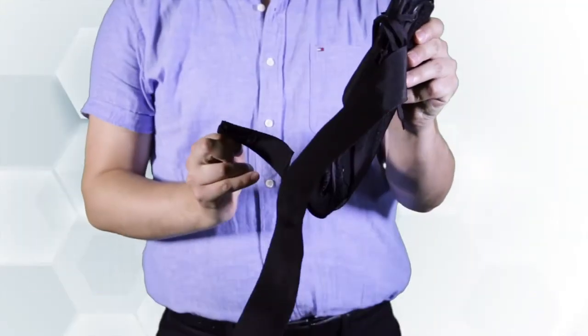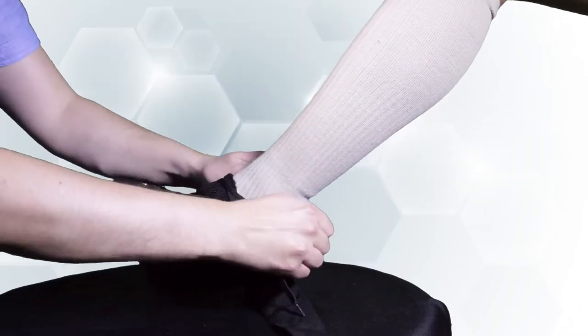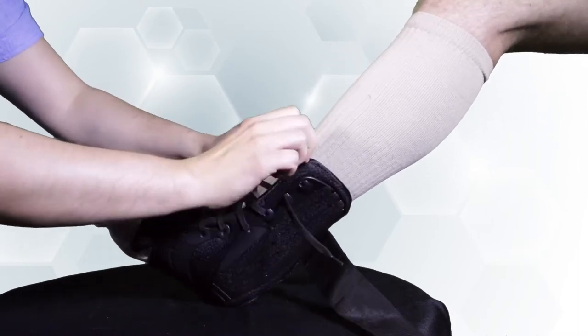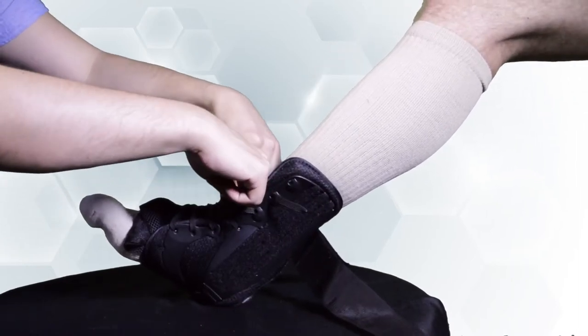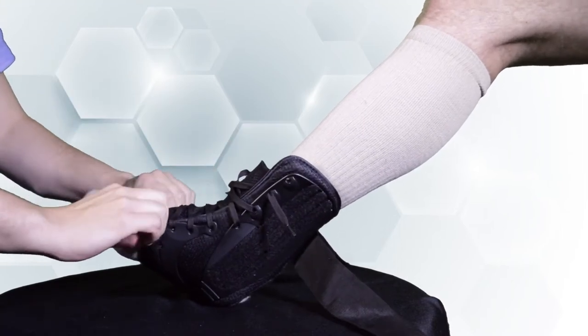After selecting the correct size, unfasten and loosen the front lacing so the support can easily slide onto the foot and up over the heel to its perfect position. Next, adjust the tongue so it covers the instep area comfortably without bunching.